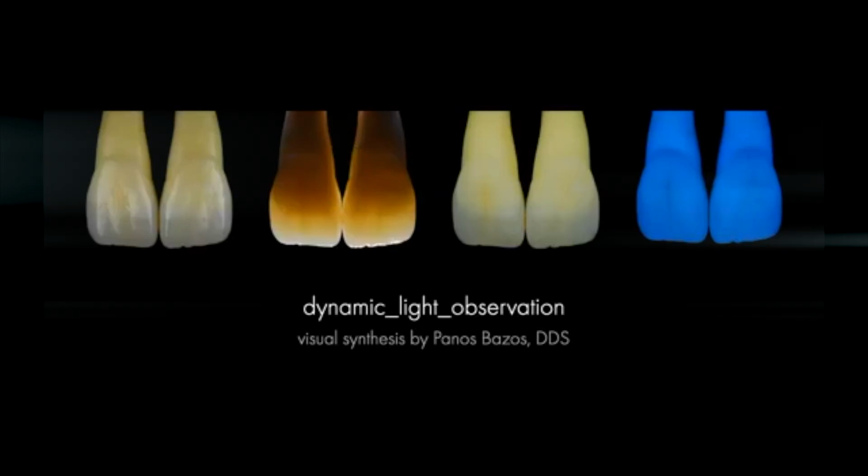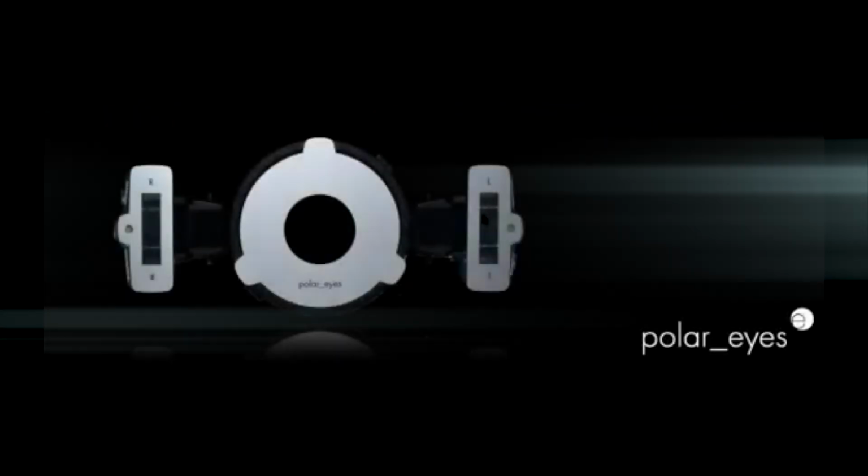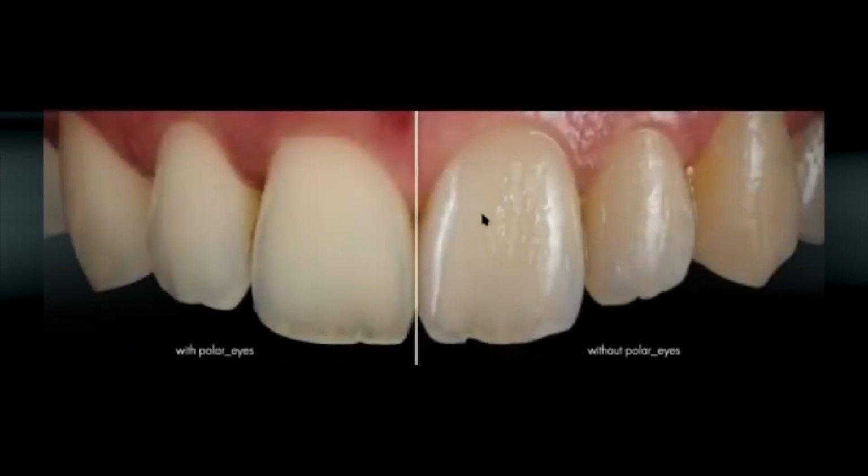But the cross-polarized light is what I want to talk about now, because this is a very useful light for us. By the use of the cross-polarization filters, we remove the specular reflection, and that helps a lot to see better the real color of the tooth. This is what we need, because the way our brain sees the color is very limited. When I'm looking at this picture, I tend to think that I can see the real color of the tooth in these areas where I have no specular reflection.